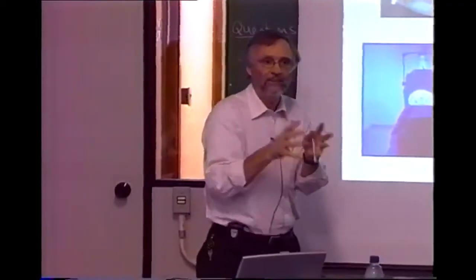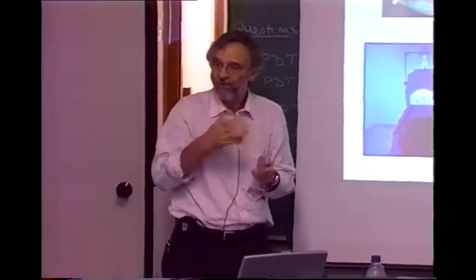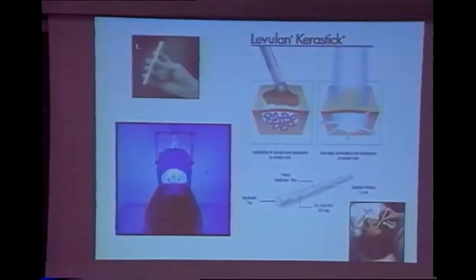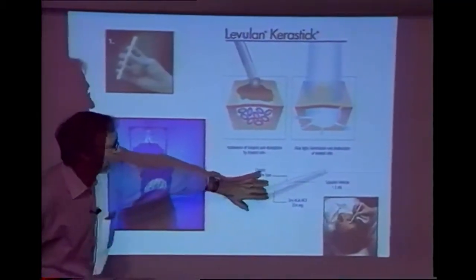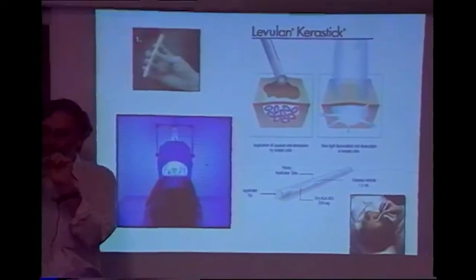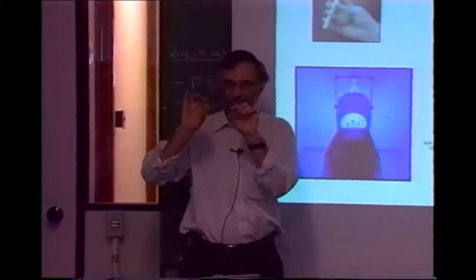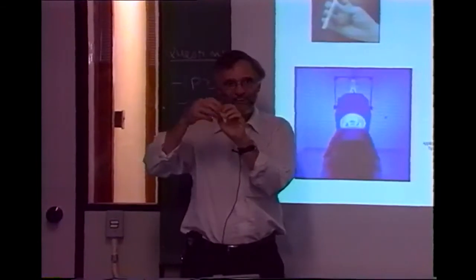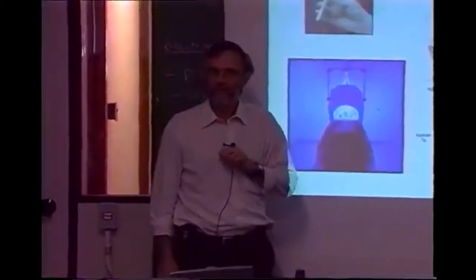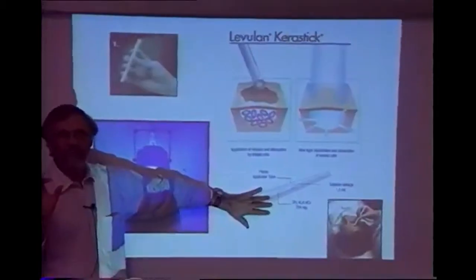How would you actually design a system to deliver the drug just onto spots? That's not trivial. So it's very nice where they've done it. This is the so-called Peristate, in which the drug is inside a plastic tube, and inside here the drug is inside a very thin glass tube. And so you just bend it, and the drug is released, and it comes out onto a cotton pad. So that's an incredibly well-designed piece of engineering.